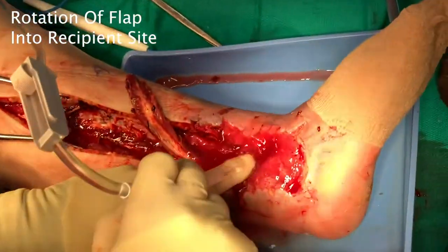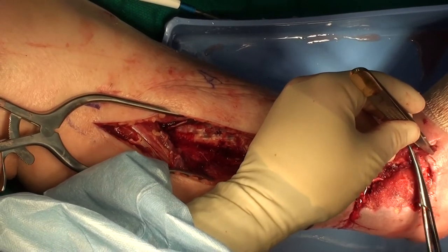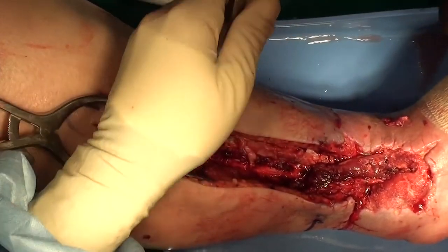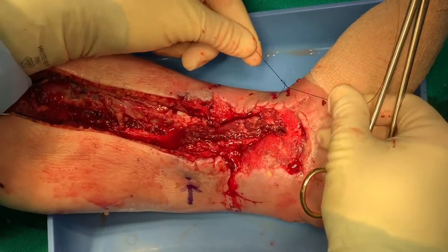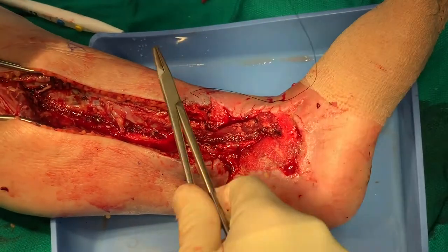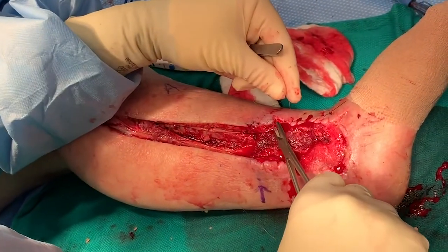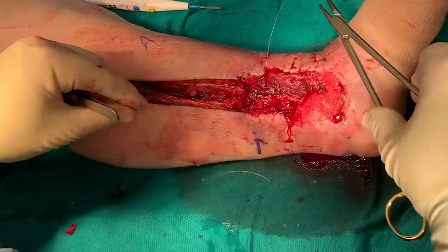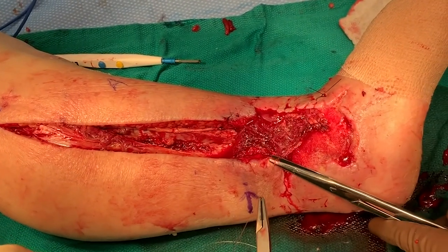We rotate the freed peroneus brevis flap into the recipient site. Because the most proximal tip of the flap will be the least viable, we debride the tip of the flap, but are careful to leave enough of the flap to fully cover the recipient site. We place a mattress pull-through stitch with a nylon suture to anchor the flap into the recipient site and then gently spread the muscle fibers of the flap as needed to cover the intended area. We secure the edges of the flap with 3-0 or 4-0 monofilament absorbable sutures to the surrounding edges of the recipient site with as little tension as possible. We let down the tourniquet to observe the viability of the flap and confirm that it bleeds.